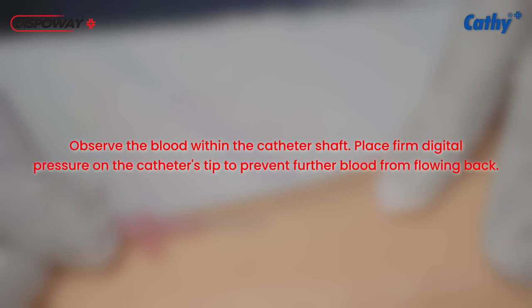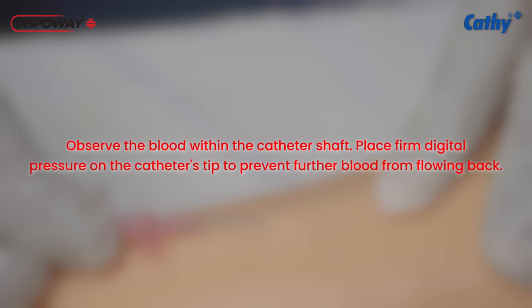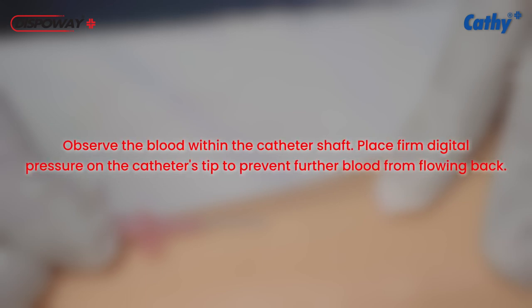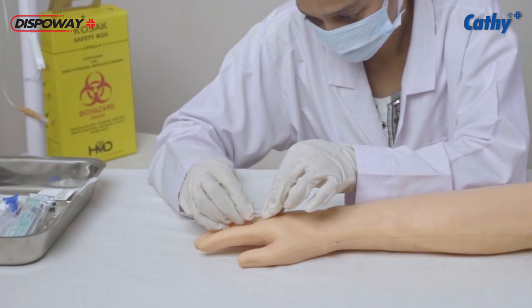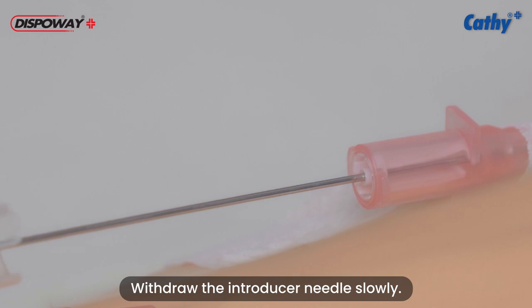Observe the blood within the catheter shaft. Place firm digital pressure on the catheter's tip to prevent further blood from flowing back. Now, withdraw the introducer needle slowly.